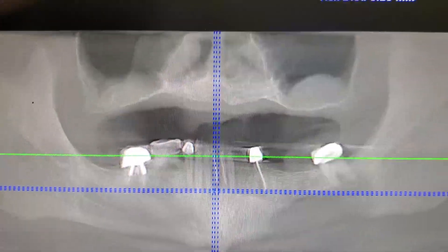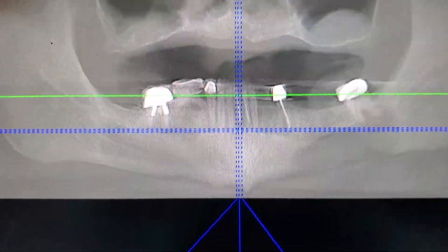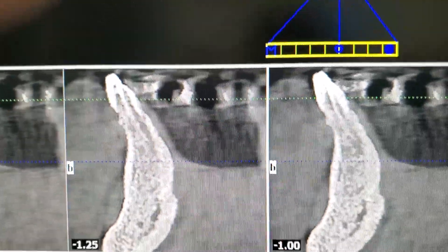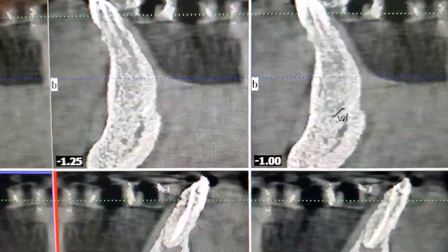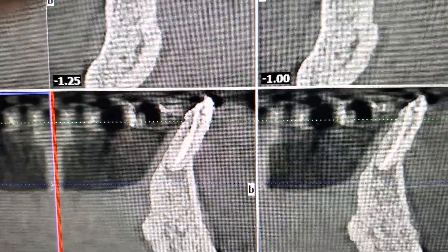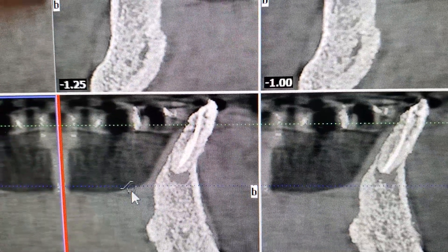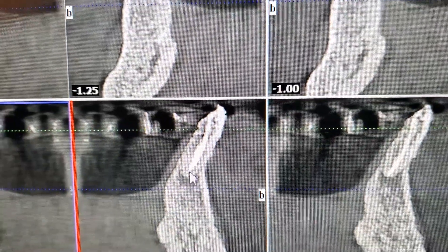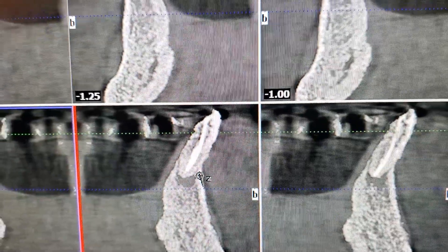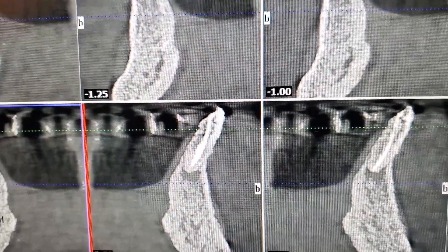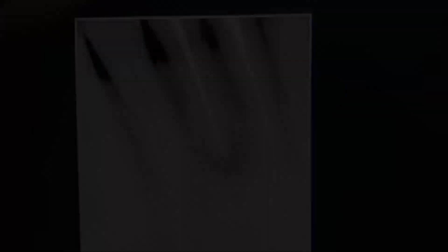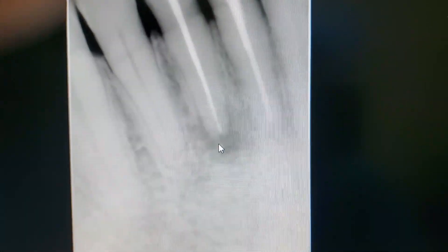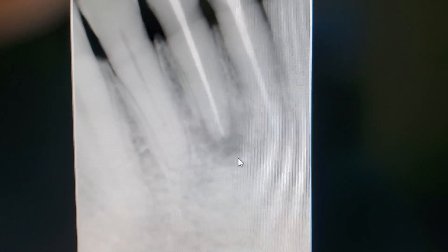When you have infection at the end of the root, sometimes you cannot see it very clearly from the front. What we do is a CAT scan, which will show the infection clearly. As you can see right here, the infection at the end of the root shows as a dark circle around the tooth. We also do this to confirm the infection after taking the CAT scan, and you can see the infection very clearly at the end of the root.